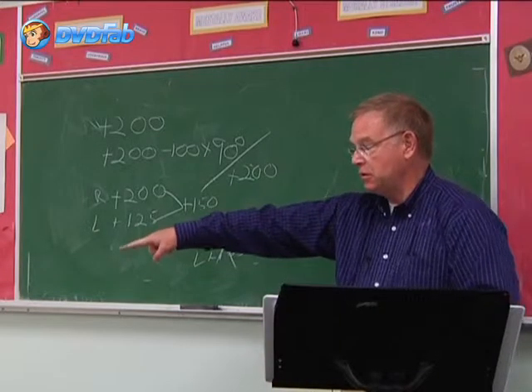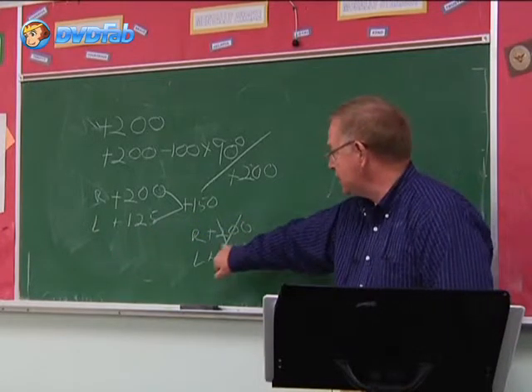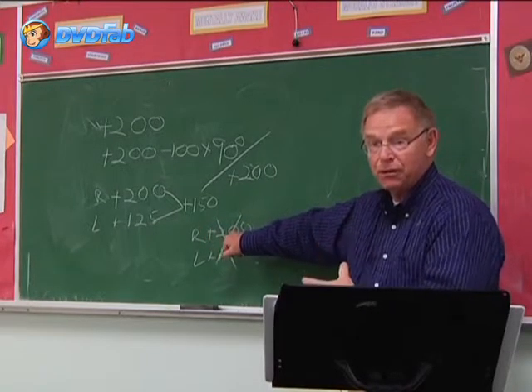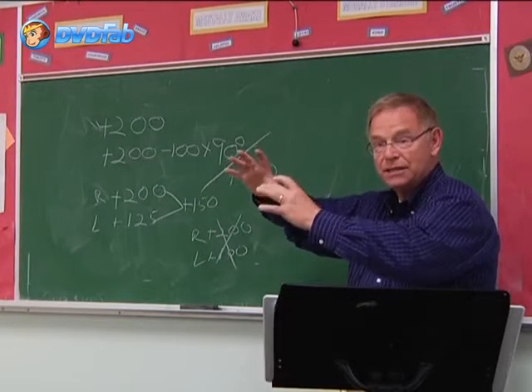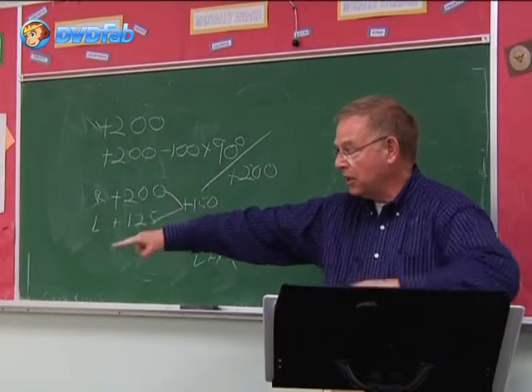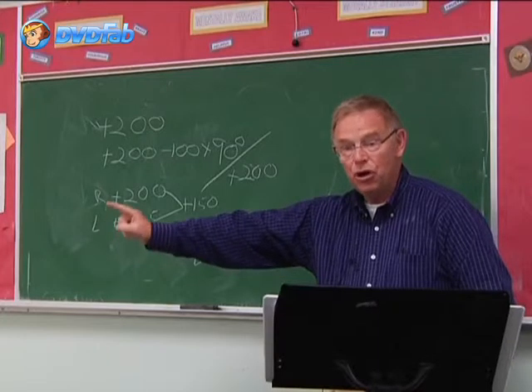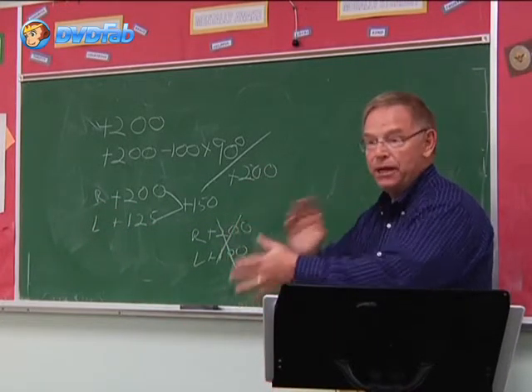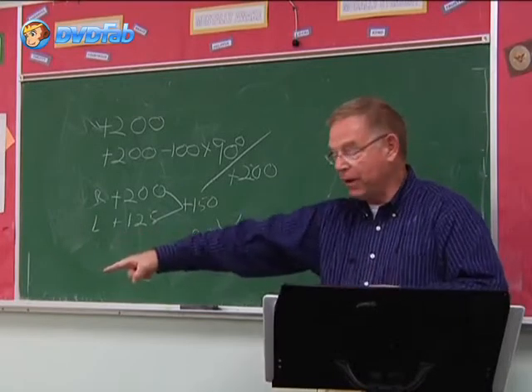No, the jig, you've got uncut lenses. This is used eyeglasses that you're trying to decide whether to accept or not. These are prescription glasses that somebody gave you that has the prescription marked on the bag. So these are uncuts. You're going to build your own there. You're going to examine the patient and determine he needs a +2 and then go over and make him a pair of +2s.